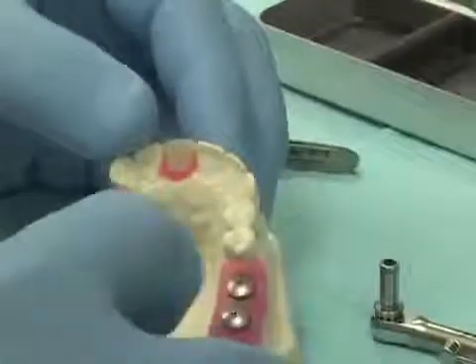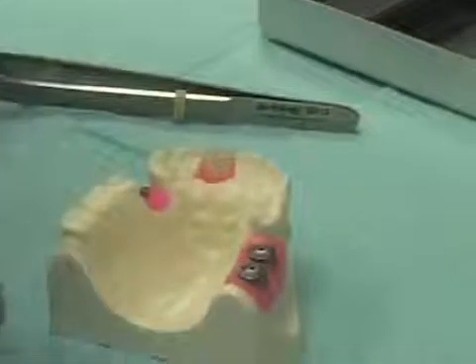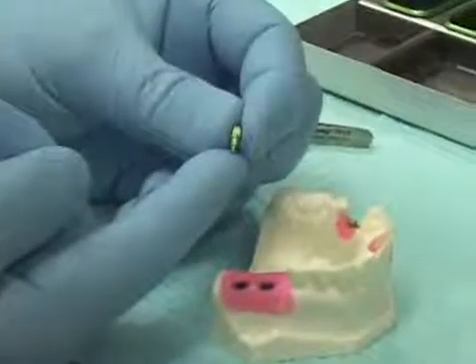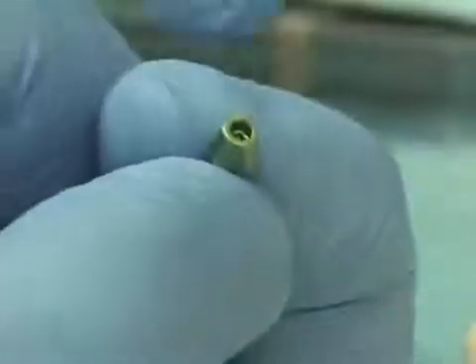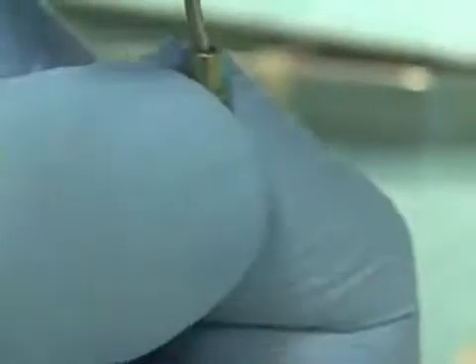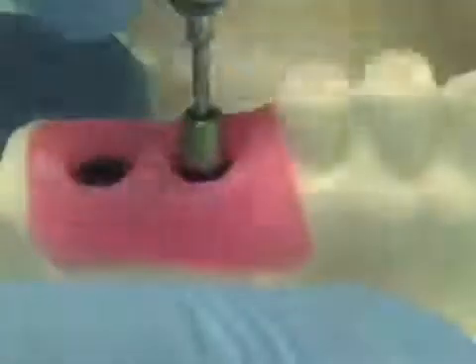What I'm going to do now is, in like manner, remove the healing abutment from our wide neck implants. Now the one difference between the wide neck and the regular neck solid abutment is the wide neck abutment is large enough on the top that the nut driver that you use to remove the healing cap is exactly the same one you can use to place the solid abutment. So here we place the solid abutment on, that's our wide neck solid abutment.